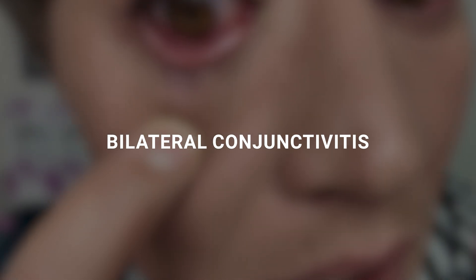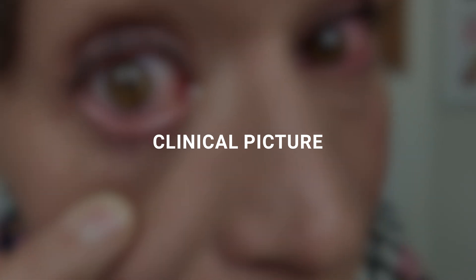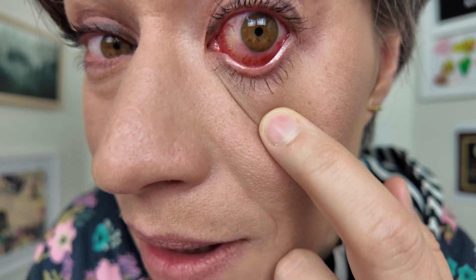I'm so excited today because I have the unique opportunity to show you bilateral conjunctivitis both clinically and under the microscope. So let's start with the clinical picture — one side and the other side.